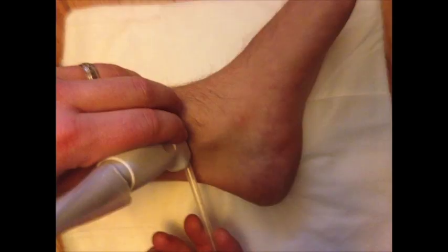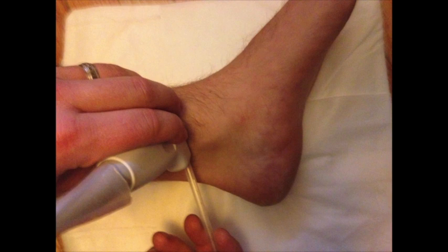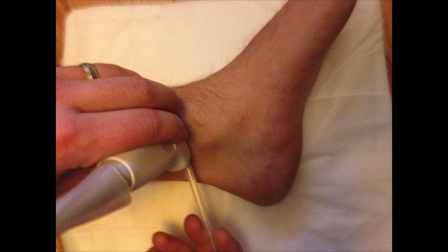Take your needle and position it in the long axis plane, so you're doing a long axis injection coming from the posterior aspect of the foot. Travel towards the posterior tibial tendon, being careful to avoid the neurovascular structures. We'll use the calibration features and go to the posterior tibial tendon.